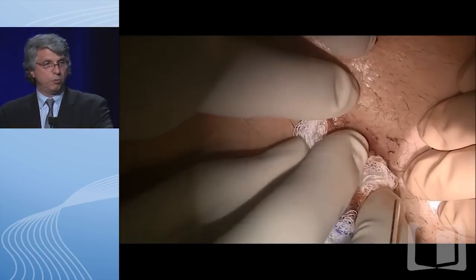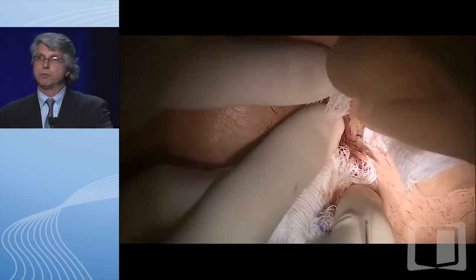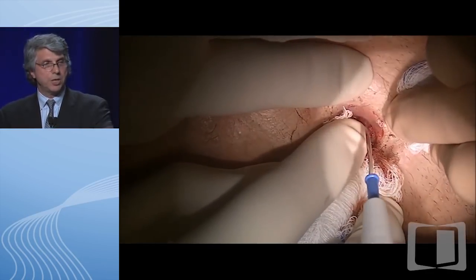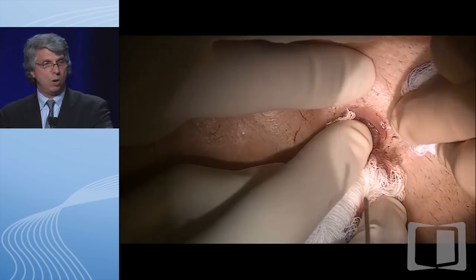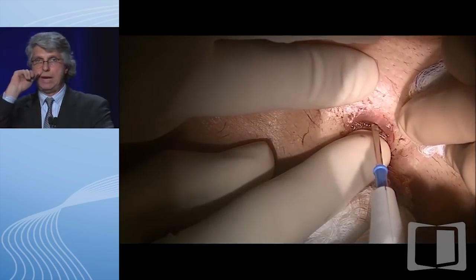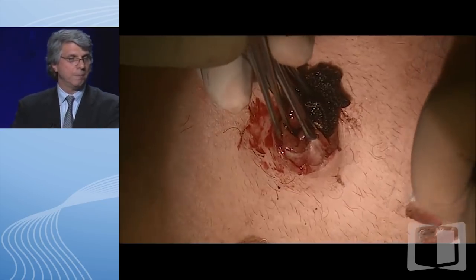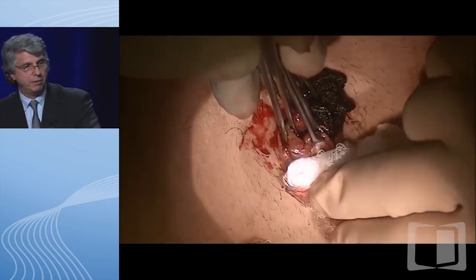Now, let's presume we've done that first procedure. The patient has recovered, and now we're doing the second of the three-stage procedures. The patient has an ileostomy. What we're doing now is taking the ileostomy down, removing the rectum, and making the ileal J-pouch. This is the mobilization of the ileostomy off the anterior abdominal wall.